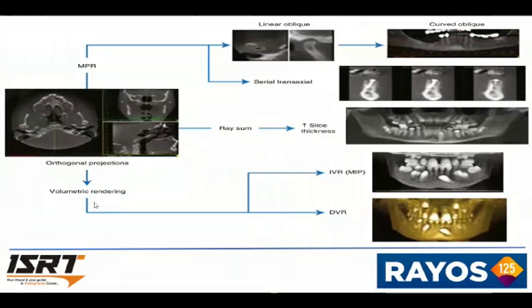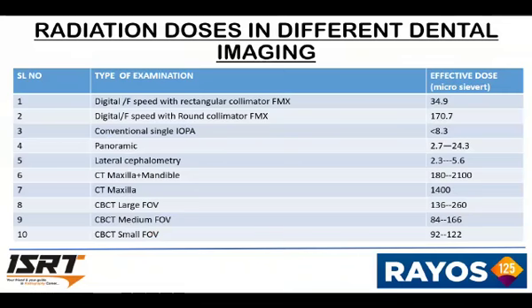And these are the orthogonal projections from axial, sagittal or coronal, and with different volume maximum intensity projection and volume reconstructions, etc.